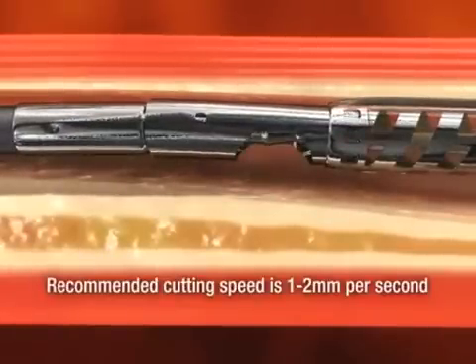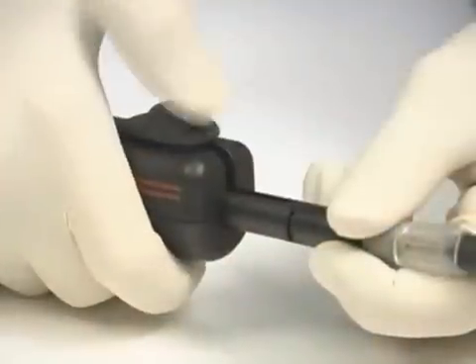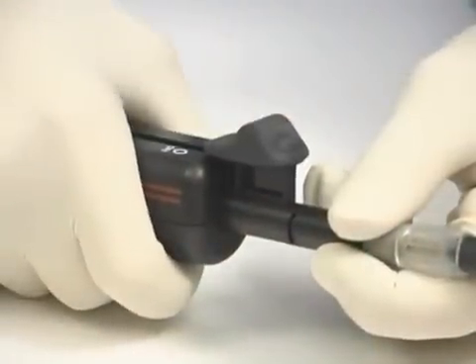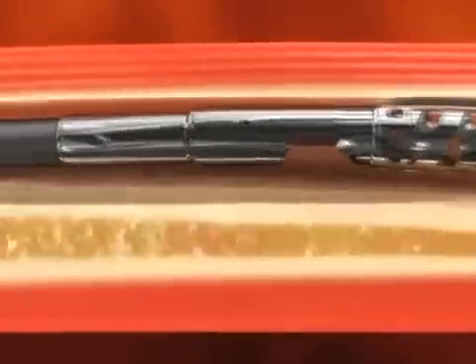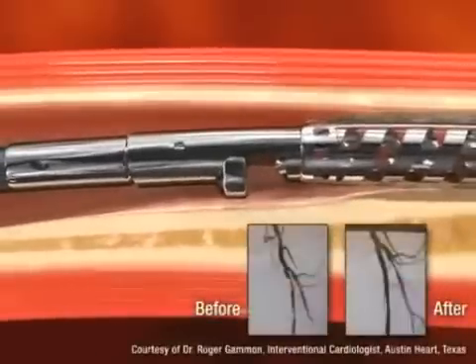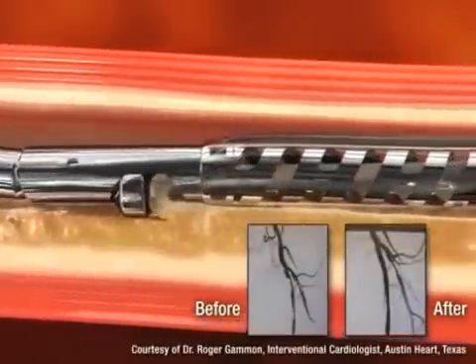Once the end of the target segment is reached, stop advancing the catheter. Carefully advance the cutter positioning lever to close the cutter and turn off the cutter driver; this will be indicated by a tactile click. Routinely view the artery using angiographic and/or intravascular ultrasound imaging to assess the extent of plaque excision.